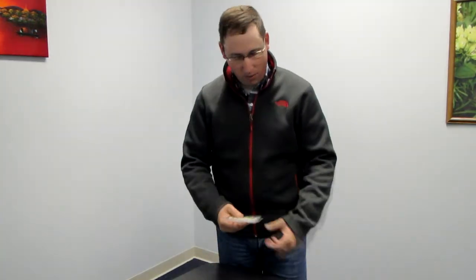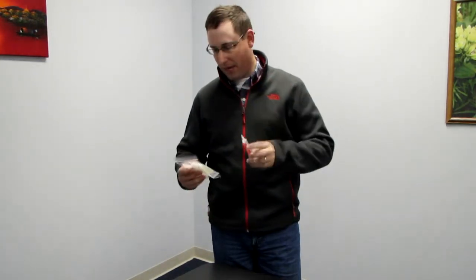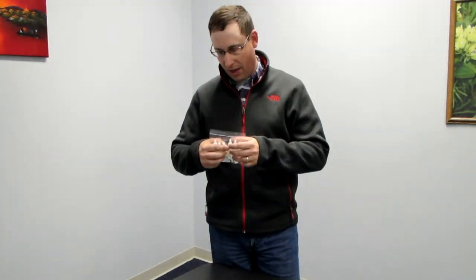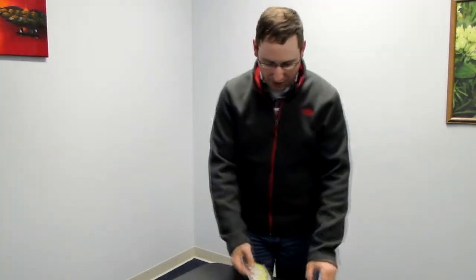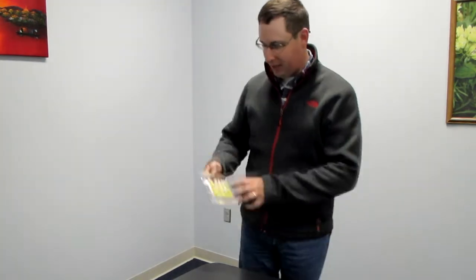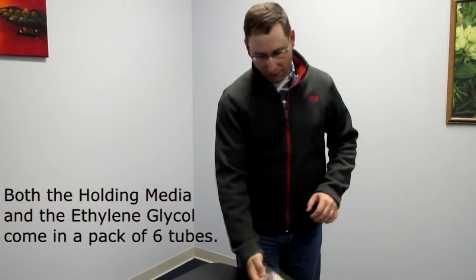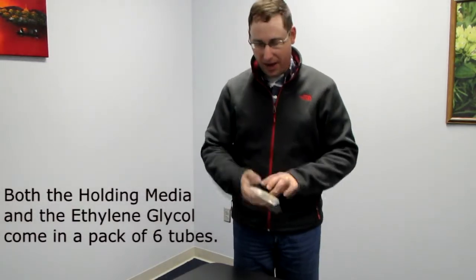Our answer to that was to come up with these individually packed medias that are 8 ml. Each one of these tubes contains 8 ml of either our standard holding and transfer media or our ethylene glycol with sucrose. These products are both sterile filled. They come in a package of 6 times 8 ml, so you get 48 total ml's in one package.